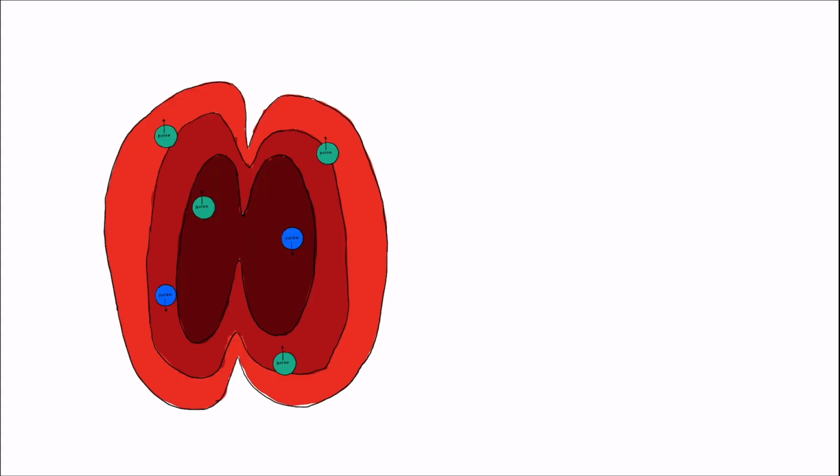Okay, so this isn't that easy, that we only have the 90 degree radio frequency pulse, the RF pulse, because there's also a concept called inhomogeneity, which shows that there isn't uniformity everywhere. So for example, you can see here this proton experiences a different kind of pull from the magnetic field than, for example, this proton will or this proton will. So how do we account for that?